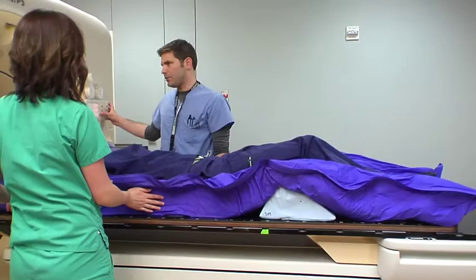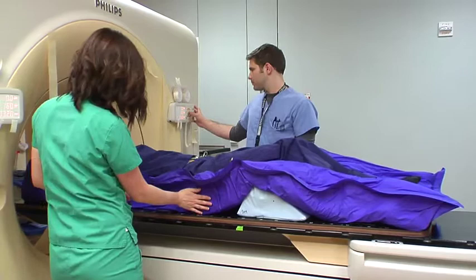If you're not going into the scanner, we're just moving in a little bit to see the lasers that we have. We're putting these pieces of tape on and we're going to mark them with the lasers so we can line up the bag itself and make sure the bag is straight when we actually get hit.